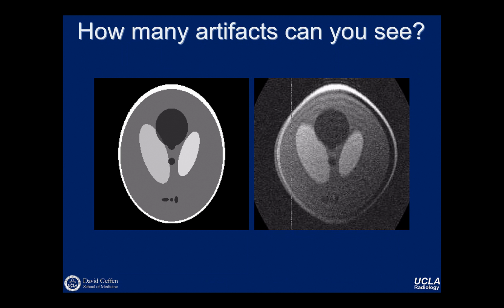What else? Yeah. So certainly you're pointing to this stripe right here, right? And we just went through RF leaks, so we don't have to say too much about that one probably. What else? Saturation. Yeah, something's going on. What do you notice? There's just kind of staticky noise and signal throughout the whole thing. There should be black on that outside. Okay, so staticky sort of noise and signal sort of on the outside. So we don't expect to be perfectly zeros, right? Like that would be unexpected. I think what you're picking up on is that the background signal here is sort of also non-zero.